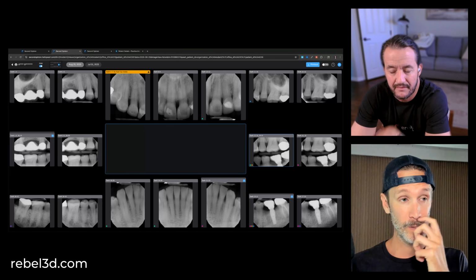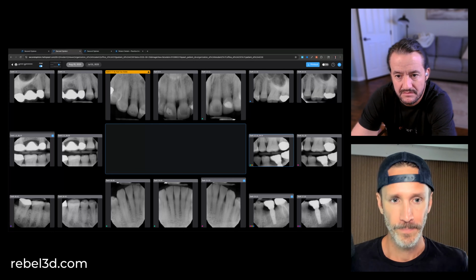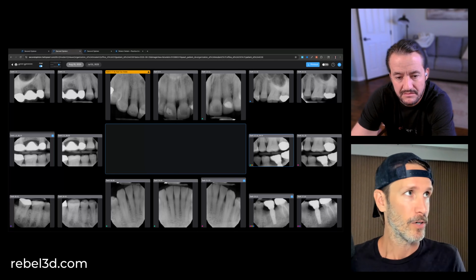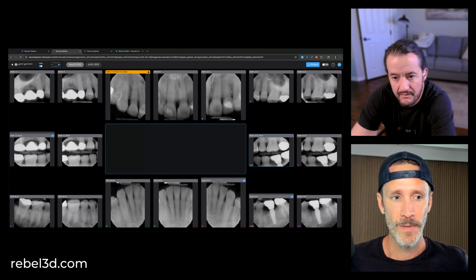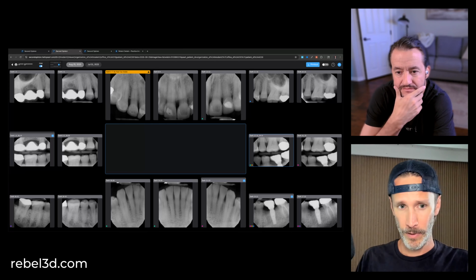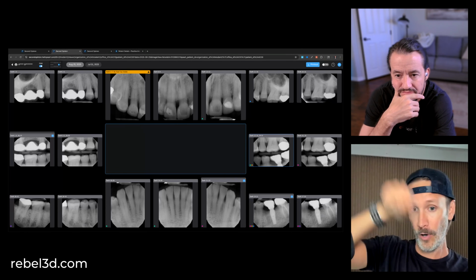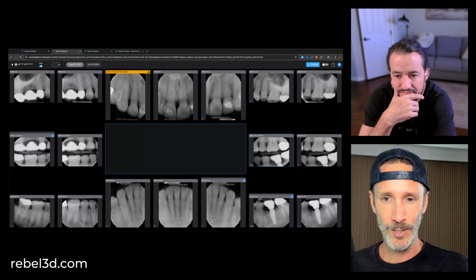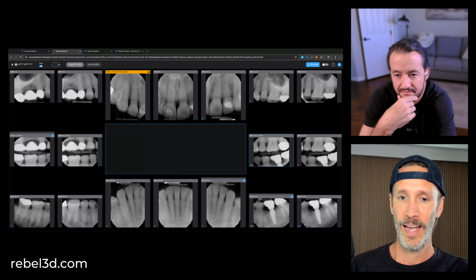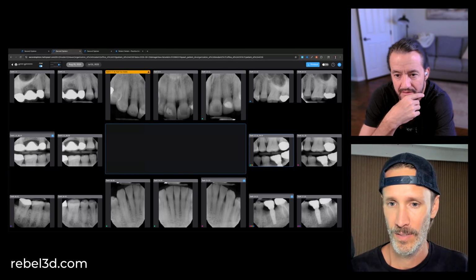Because I remember when I first got out of dental school and out of residency, I was working at my buddy Matt Najad's, who's now my partner at my practice. He had a previous practice that we were working in together, and we would print out a piece of paper, take a red marker, circle something, put an arrow, caries or something like that. And that would actually help us get insurance reimbursement at the time. And it's kind of just doing that automatically now.